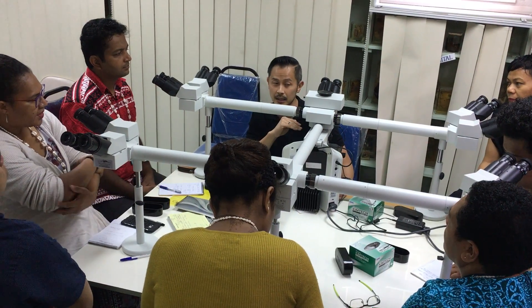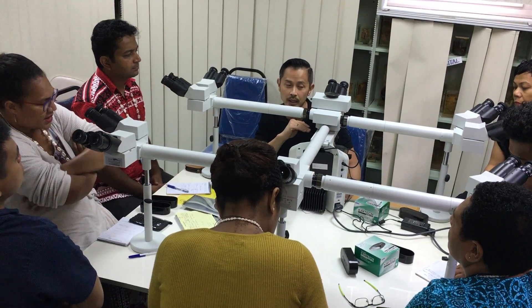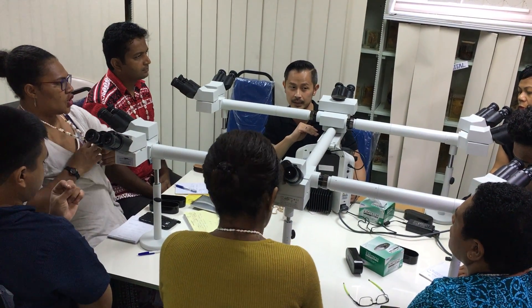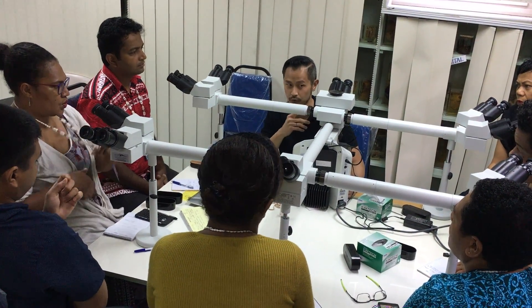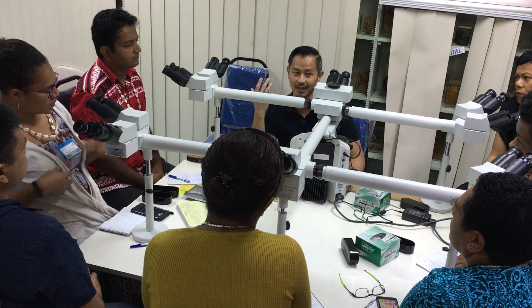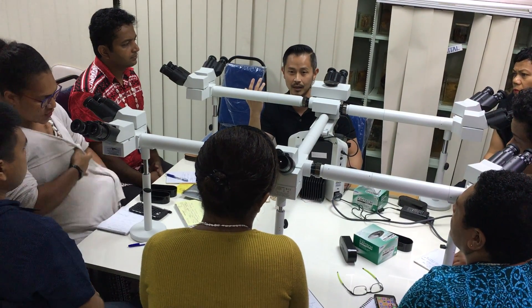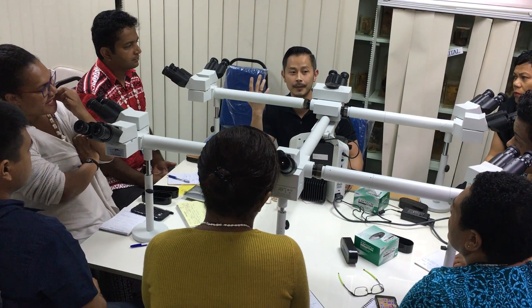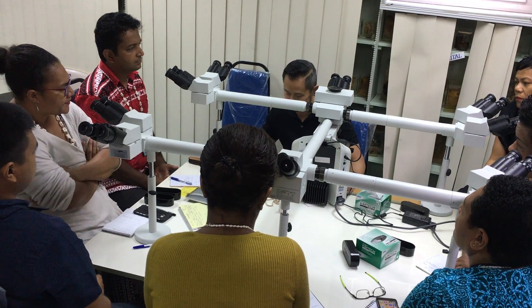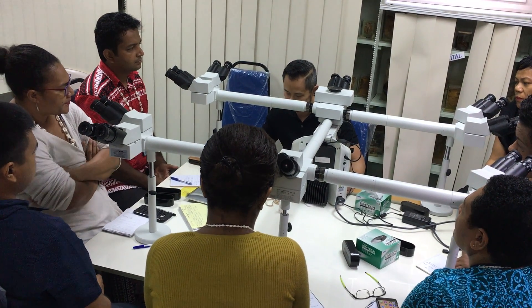So in this case, is it looking like mesothelial cells? No. So you already want to confirm — is this some other thing? It didn't look so. C.A. — carcinoma. Thank you.